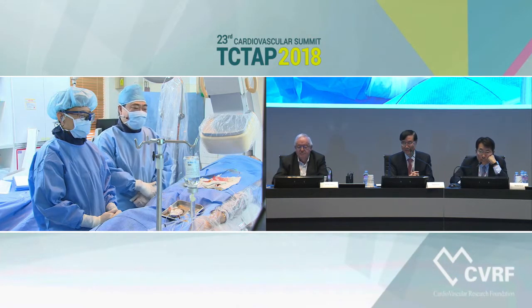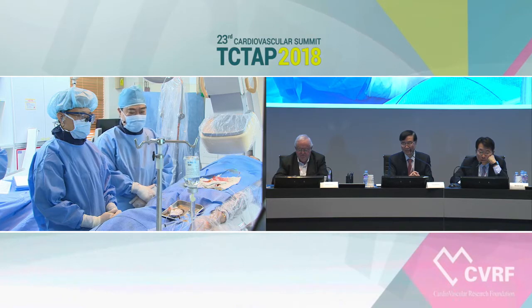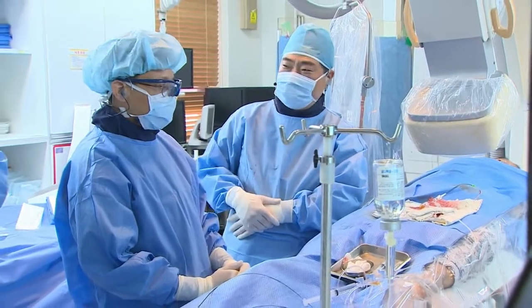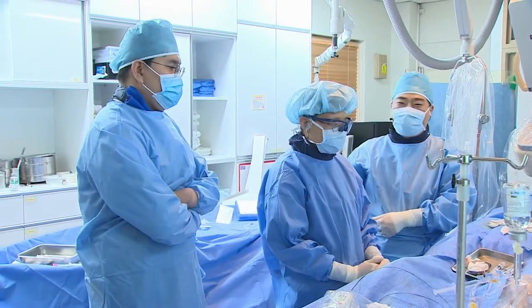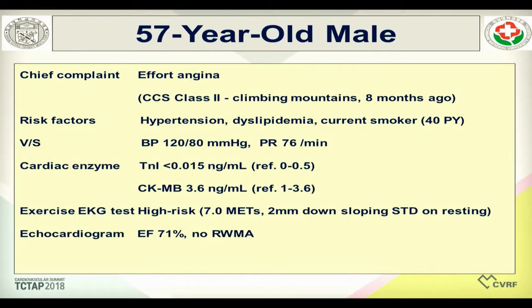It's a very great honor for us to attend this live session in TCTAP. I introduce my team. It's John Kim, the second operator is Dusan Sim, the third operator is Sung Shigo, and the IVUS commentator is Yongcheol Kim. So please introduce your case and approach.